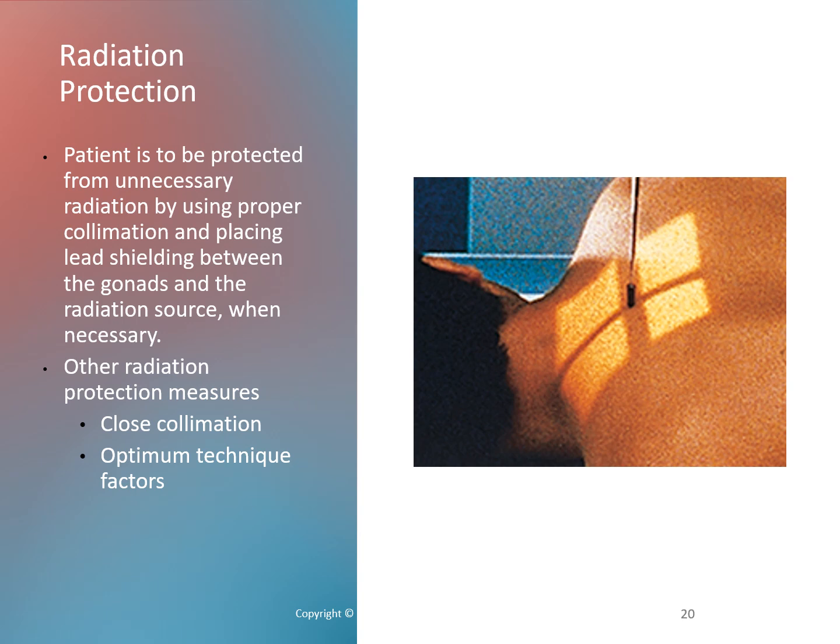Radiation protection. Patients should be protected from unnecessary radiation, and there are a couple of strategies for this. We need to shield, obviously, the gonads. The areas of interest for all these exams in this unit are nowhere near the reproductive organs, so no reason not to shield. The other thing you can do is not expose all the tissue, just expose the tissue that is necessary to demonstrate for the particular exam.